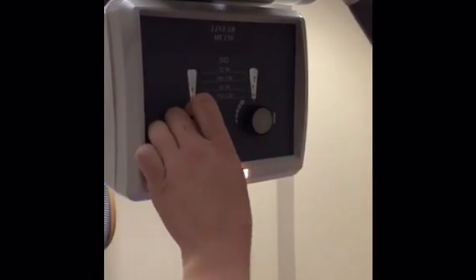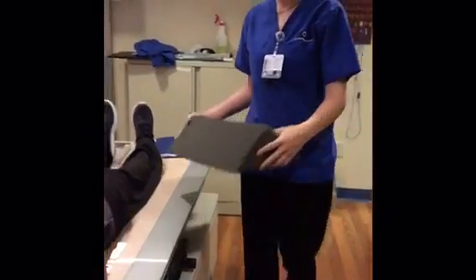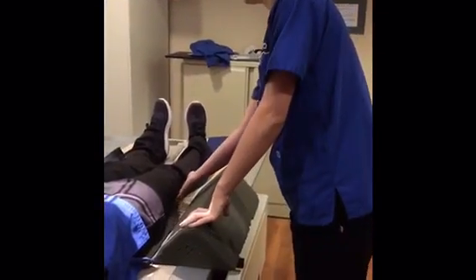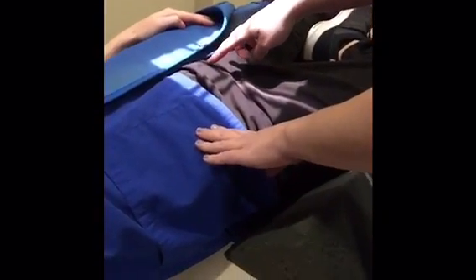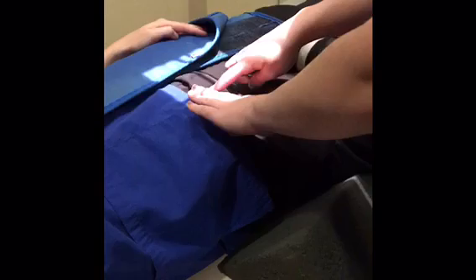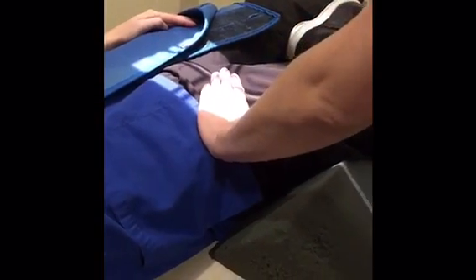Looks good. For this projection, I will be using a sponge to help immobilize my patient. My patient will bend her right knee up and fan it out, keeping her right foot to her left. Her ASIS and her symphysis pubis, drawing a line and meeting in the middle. I will again go diagonally 2.5 inches, so I need to move my patient.